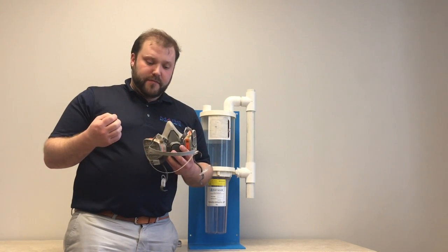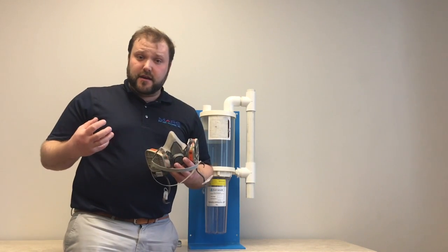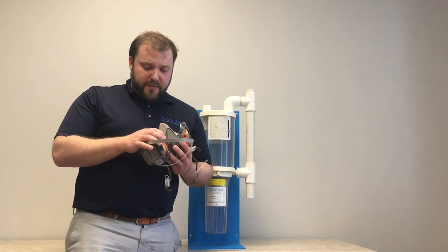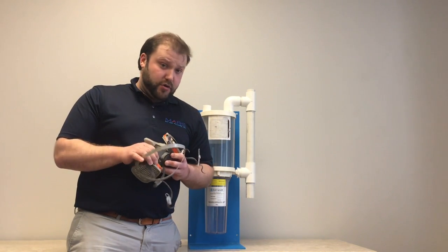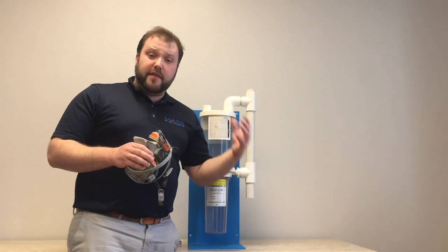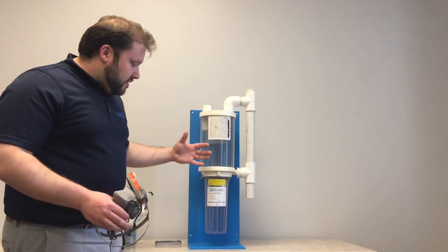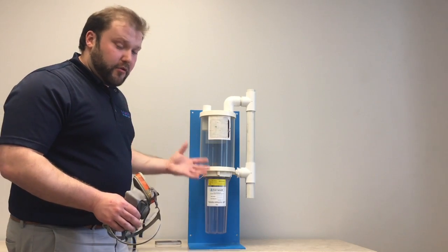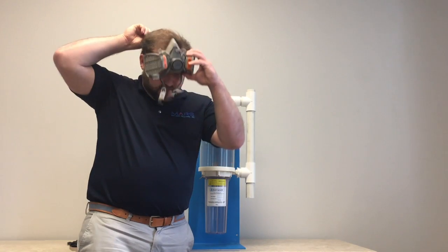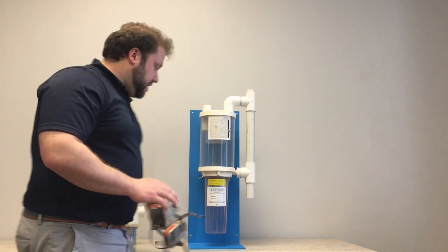When mercury amalgam sits in water, it dissolves into a soluble form because the tin has an ionic charge that releases mercury into a gas. What happens is when you mix biological material, blood, saliva, with elemental mercury, you get methyl mercury. And that's what happens in amalgam separators. They create methyl mercury. So I would wear a respirator like this. This is a 3M respirator rated for mercurous gases.